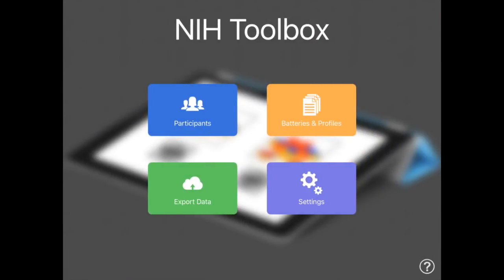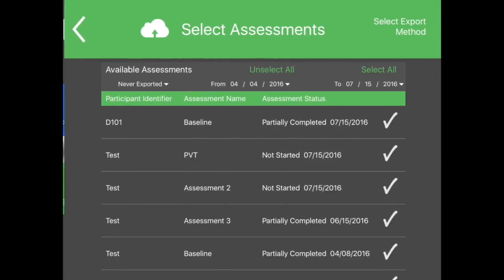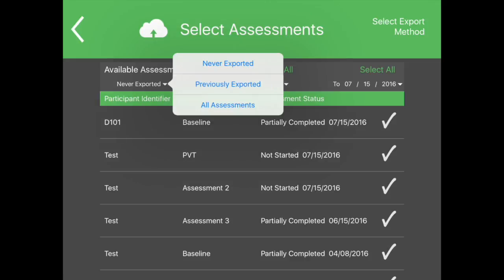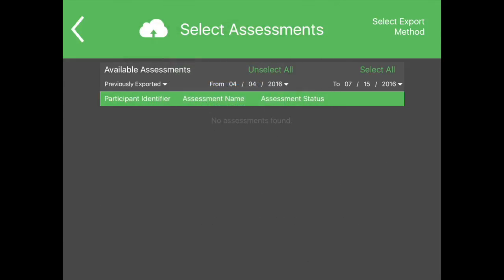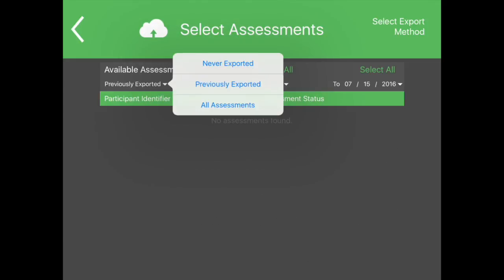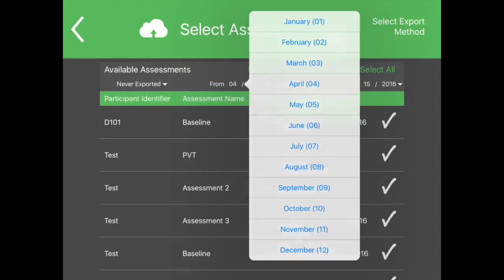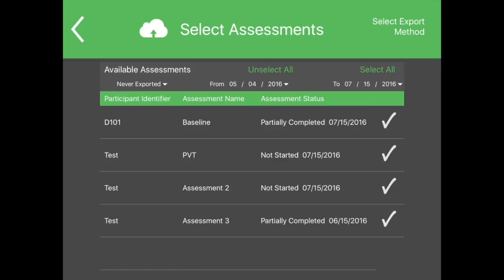The Export Data button allows the user to export data collected on a given iPad. Select the files to export by using the filtering options. The default selection will be data that has not been exported yet. Files can be filtered by export status and a date range. To choose a file for export, tap Select to the right of the assessment that is ready for export. All assessments can be selected by touching the Select All option. Assessments that have been selected for export will show a check mark instead of the word Select.